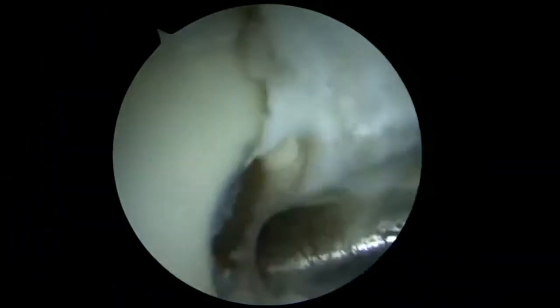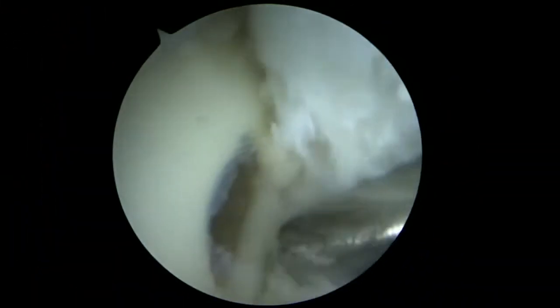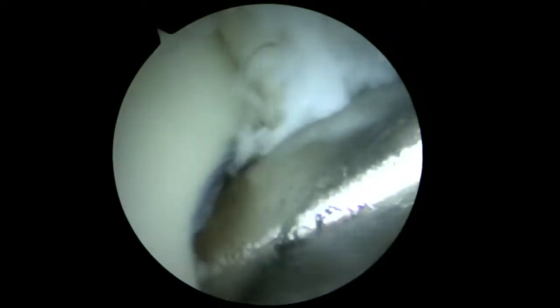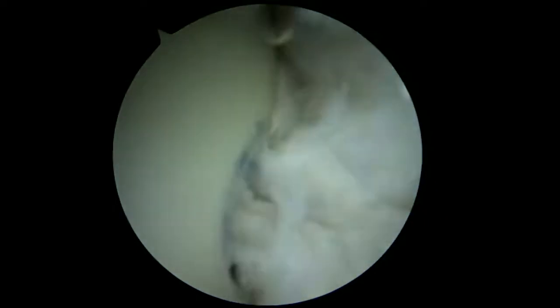A 10mm hole is drilled in the proximal pole of the scaphoid with a 3.2mm cannulated drill bit. Any soft tissue surrounding and inside the drill hole is then cleared.